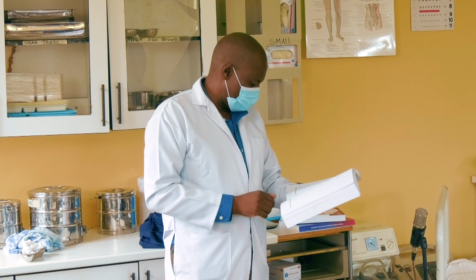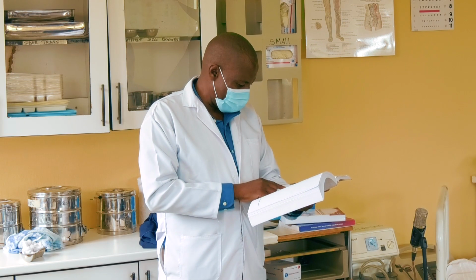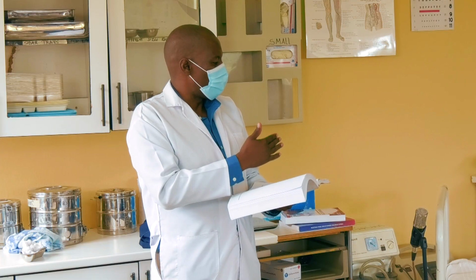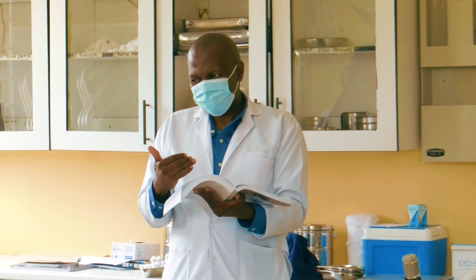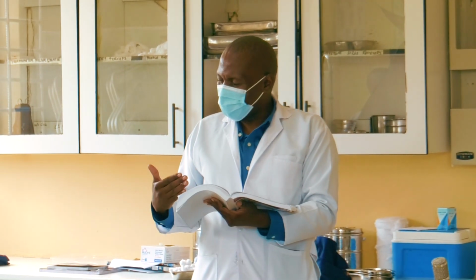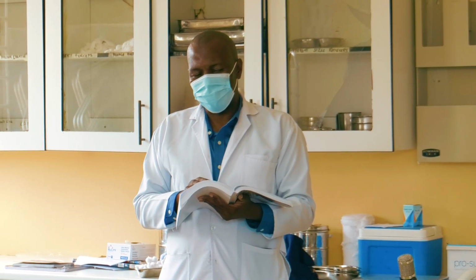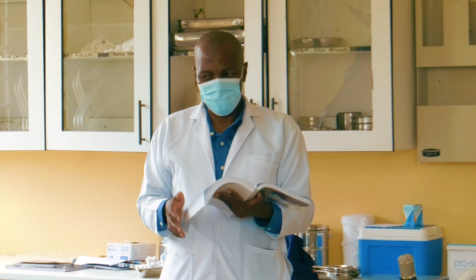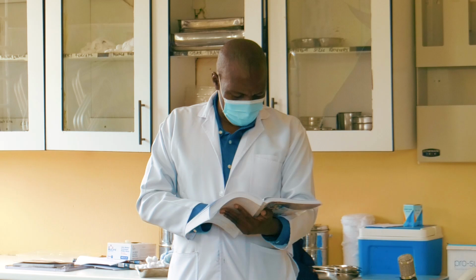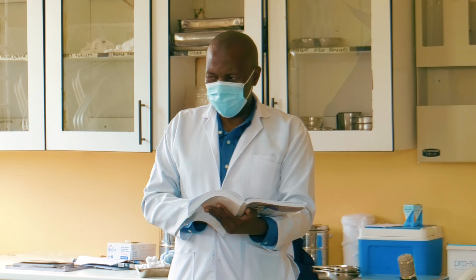What is the purpose? We want to protect the wound from microorganism contamination, aiding hemostasis. There are certain wounds where hemostasis, or blood clotting, should happen on its own. But if the wound is too big, you need to aid this hemostasis by suturing or closing the gap that is bleeding.